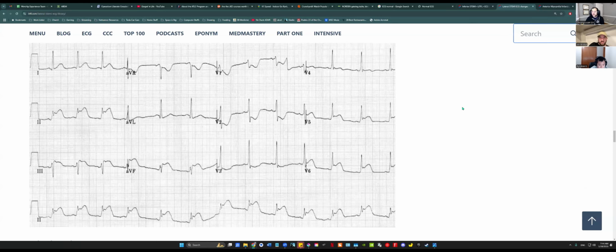Would you say anterior and right then, or do you just not pay attention to aVR? A lot of times people don't pay attention to aVR. The joke is that if you have an aVR, that means the machine's working. Mostly because it's so far out there, just out on its own. Remember that sphere diagram? So much of the heart is at the left side of the chest anyway. All the piping goes towards the left.